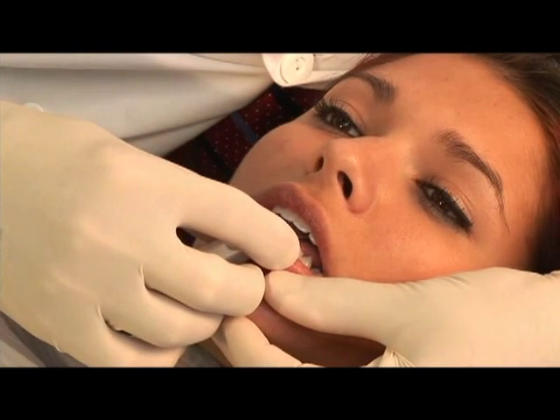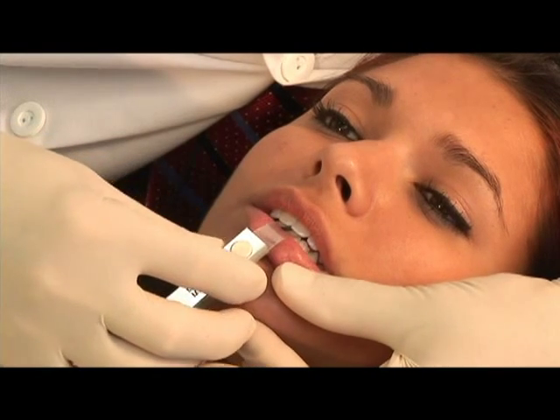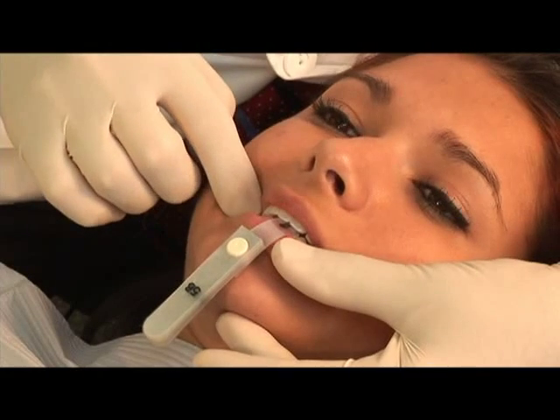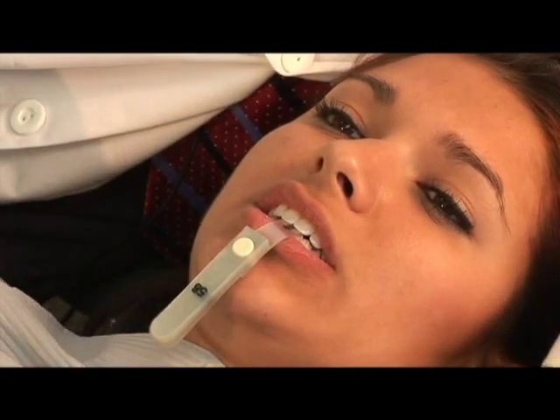Okay, close. Slide forward and back. Feel any teeth contacting now? All right, back here on this back right side? Yes. Okay, good. Let's check that.